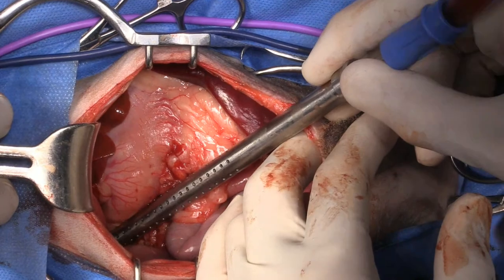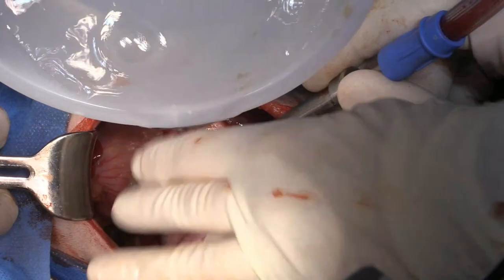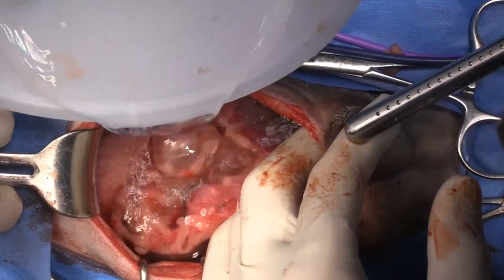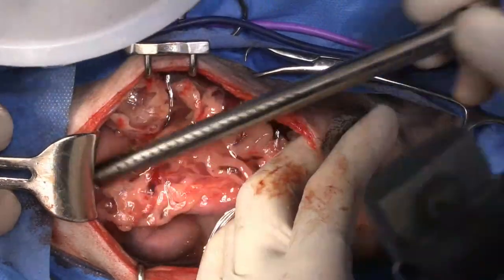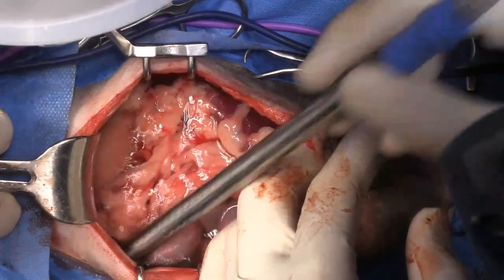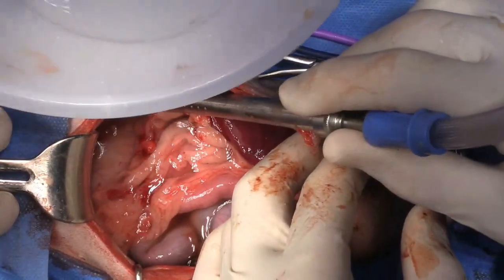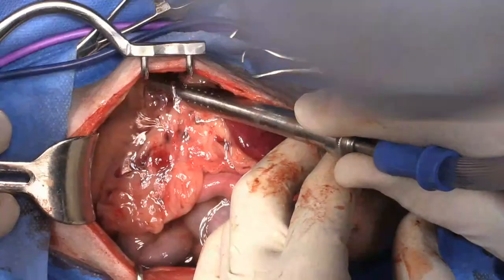Okay, go ahead and flush. Go ahead and pour it right in there. Fill her up. So I'm using this to see how much bleeding we're having as well. And we can see that that saline is staying pretty clear, which means that even though we've got some oozing of blood from the liver, it's not significant.